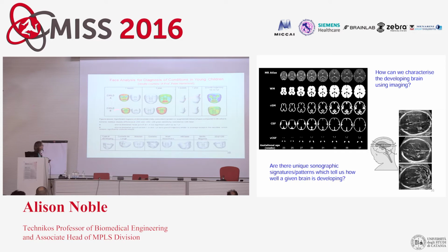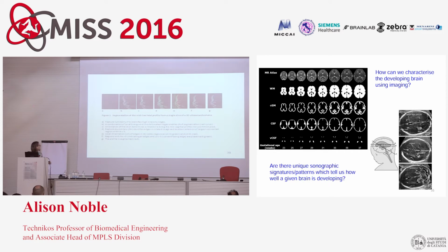He does some really, really beautiful work. But what he came to talk to me about was, could we start to do that sort of analysis in the fetus? Because if you're going to be able to intervene for some of these conditions, you need to have that information from fetal scans, particularly for a condition called fetal alcohol syndrome, which is due to mothers drinking alcohol during pregnancy.